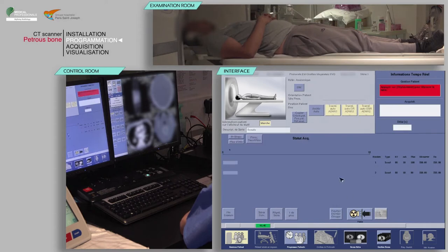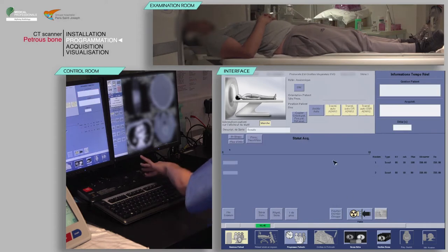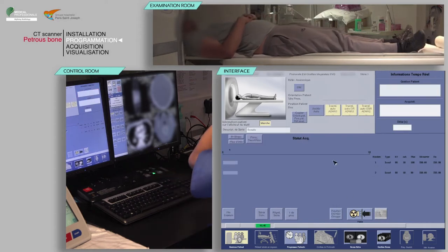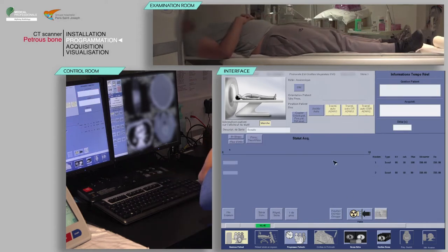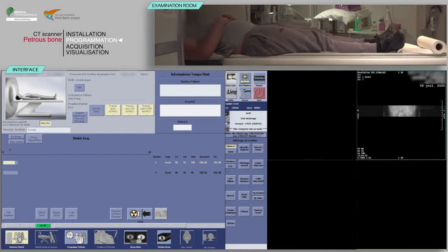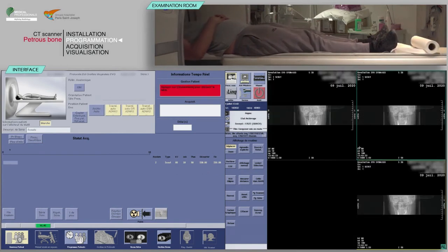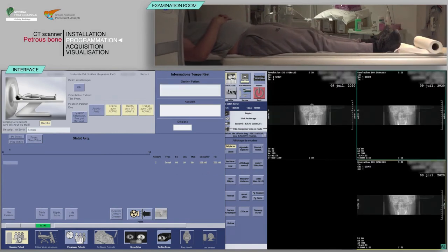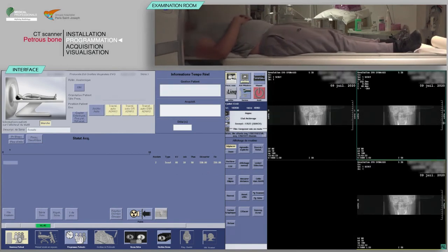On the keyboard, move the table and launch the acquisition when the buttons flash. Repeat to obtain the lateral view.